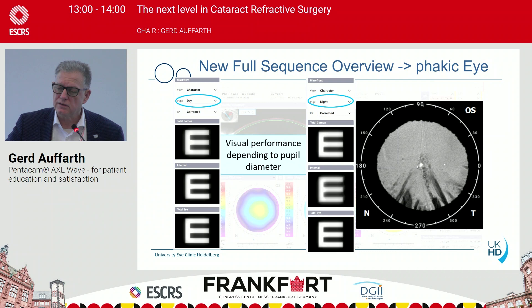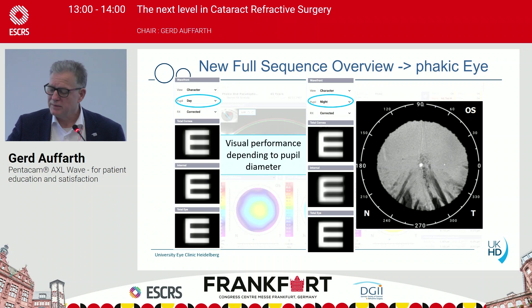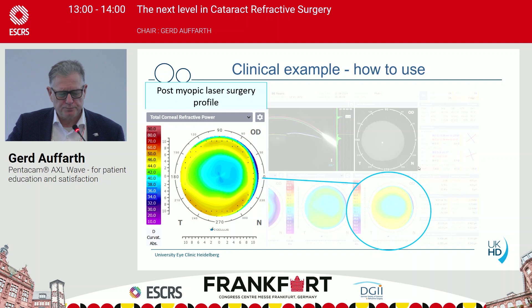You have a slit illumination photo that gives you an idea that there is maybe a cataract. You can actually document the cataract even in a case who is still able to see 0.8. You are doing cataract surgery and you can make sure the insurance company is not suing you because you can document there is a cataract. There are also patients where you must expect very low visual acuity, but in reality they still can see 1.0, correcting with glasses for corneal nuclear sclerosis — still have a dense cataract but can see decently. You can document that very nicely.